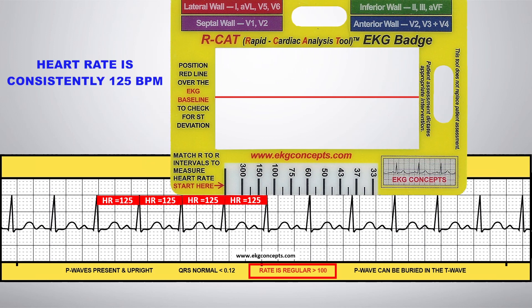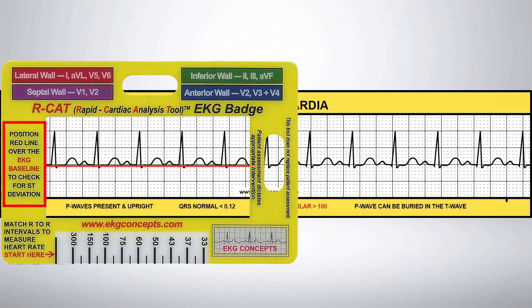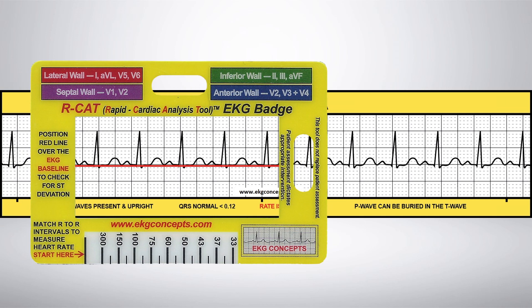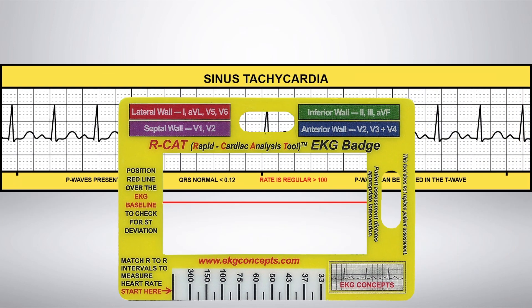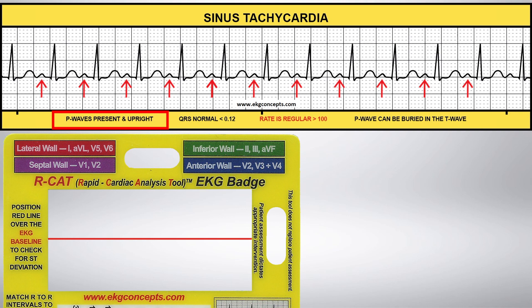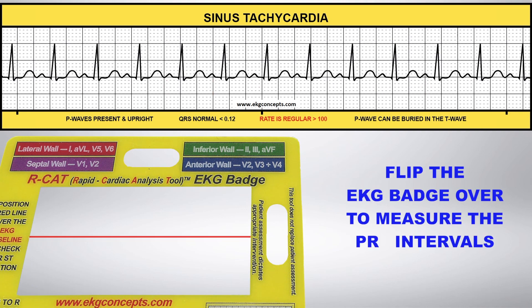Position the badge to slide the red line over the EKG baseline to look for ST deviation. Here there is no ST deviation. Notice that all the P waves are present and upright.